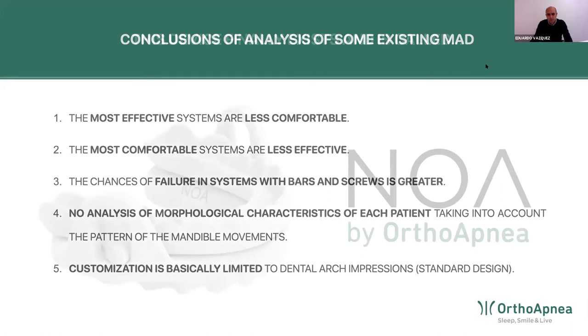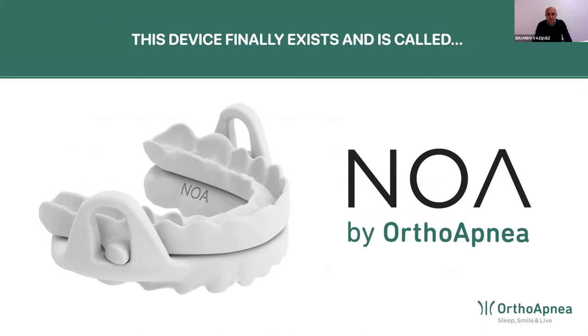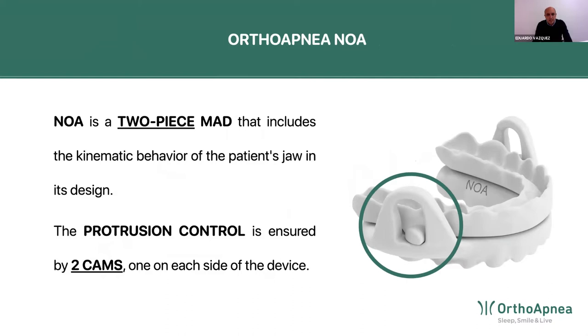So with IDEA, the OrthoApnea division and the mechanical engineering department of the University of Malaga designed the OrthoApnea NOA device, which is the device that you can see in the slide. So what is the NOA? The NOA is a two-piece MAD that includes the kinematic behavior of the patient's jaw, of the patient's mandibular movements, into its design.